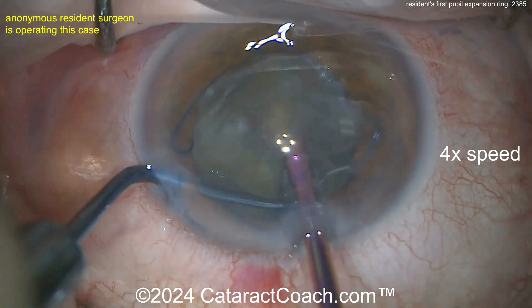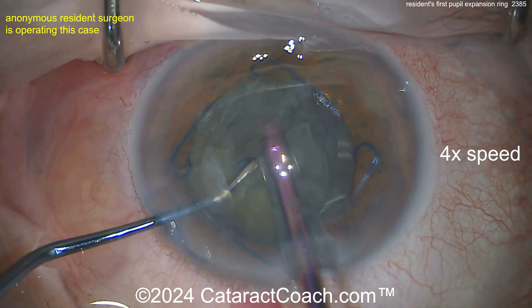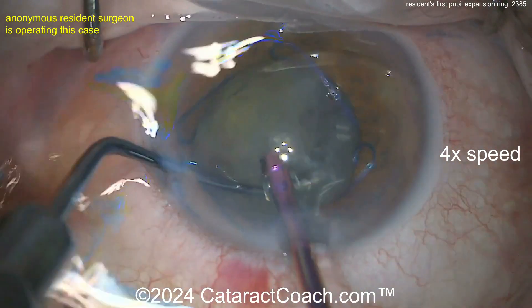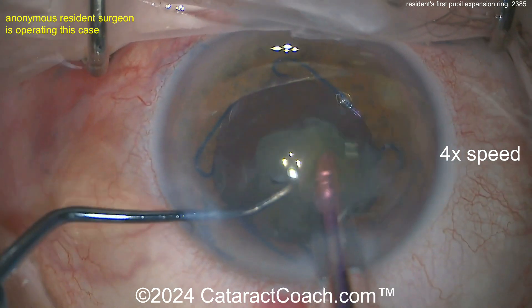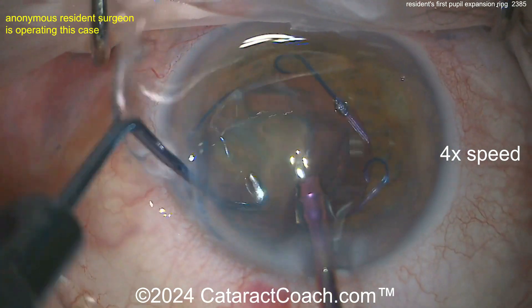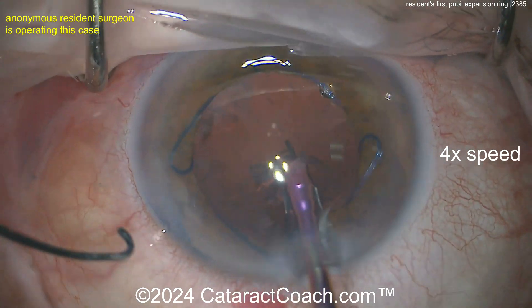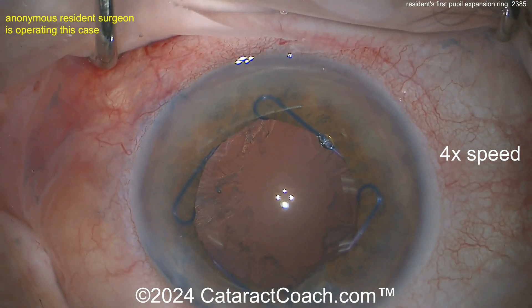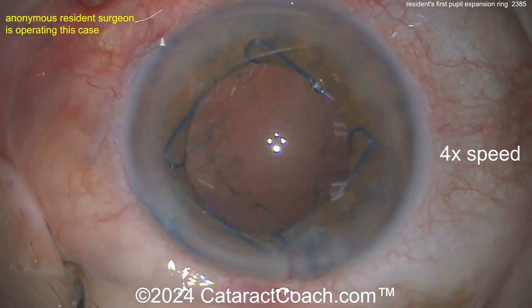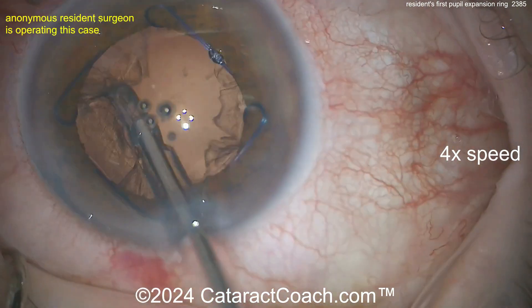Good hands here. We've sped the video up — the slow parts are at 2x and this is 4x, so the case in real time was probably 18 to 20 minutes. Aspirating these pieces out with good control, keeping the eye pretty much in primary position — the draping is pretty good too. Nice case. At the end, getting all those pieces out — careful on that posterior capsule. Now it's time for the I/A probe; not a whole lot of cortex remaining, clean that up pretty easily.